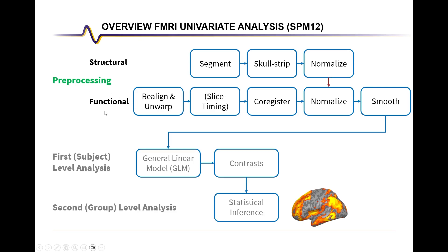For functional pre-processing, this involves realignment or motion correction, as well as distortion correction, also called unwarping. In SPM 12, it's possible to do both of these in one step called realign and unwarp. There's also the option to do slice timing correction, which is somewhat controversial, so you can choose whether to perform it or not. Then we will co-register the functional images onto the structural images to apply the normalization into MNI space, and finally perform smoothing as the last step of pre-processing.